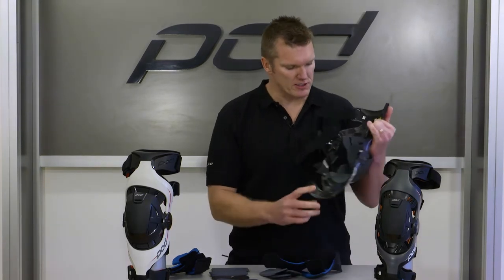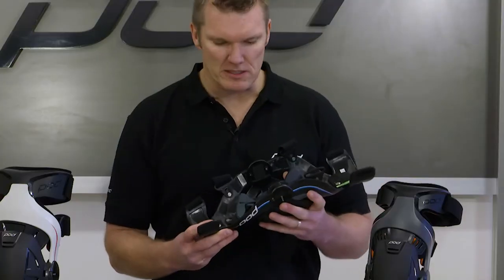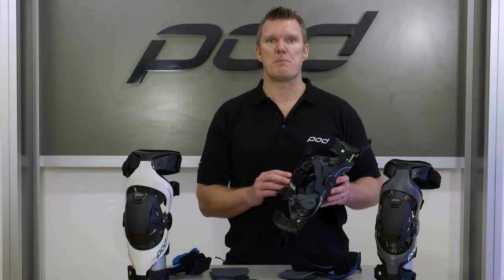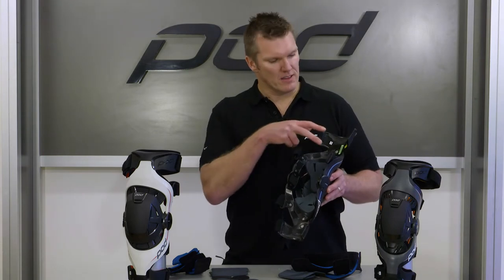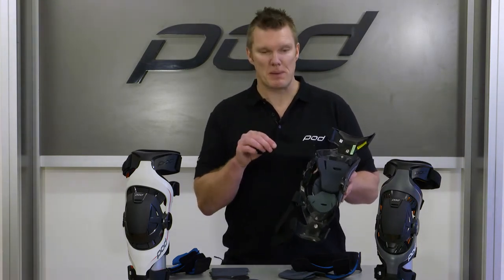Once you've taken those off, you can inspect the brace. Make sure there are no surprises, nothing's missing, and all the male Velcro should be in place. When you open up your padding bag — whether it's the K1, K4, or K8 — you will have the two lower frame pads and the two upper frame pads, as well as the first and second strap pad.